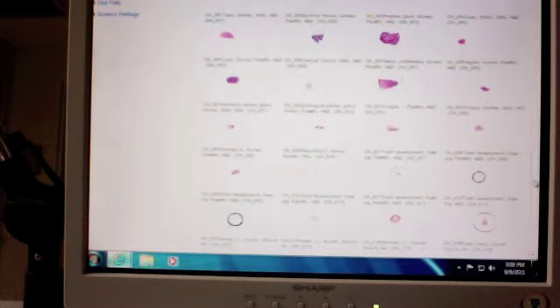On that last slide, if you were asking for the epithelium and not the structure, would you specifically say what epithelium is above? If I want the epithelium, I'm usually going to ask you what is this epithelium. Because if I'm asking for an epithelium, it needs to be some kind of lining epithelium. If I'm asking for what kind of tissue, that tissue is an epithelium versus connective tissue, for example. Or if I say be specific on the tissue, it could be a loose connective tissue or a dense connective tissue.